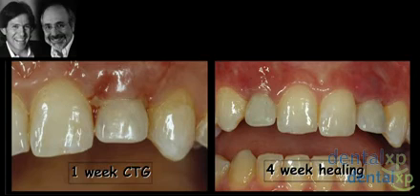And today, at least for me around implants, we would probably use more tunneling approaches and really do that so we don't have to, as Dennis mentioned earlier, worry about lifting the interdental soft tissue here. Very important, especially around previously placed implants. You don't want to lose the interdental tissue and raise a large flap. So doing this in a tunnel approach, I'd probably enter this today from the distal to canine and tunnel across with maybe a dermal graft, dermal tissue. We wouldn't even have to use autogenous tissue.